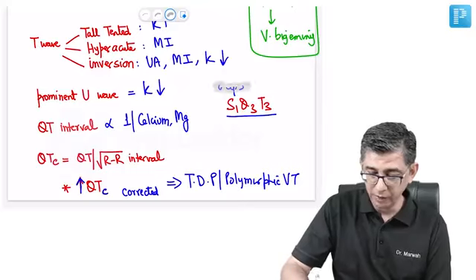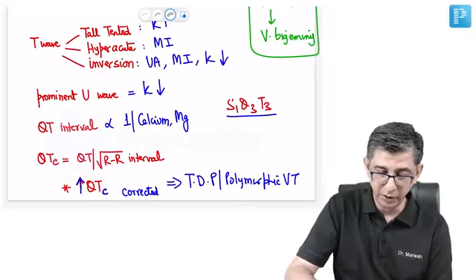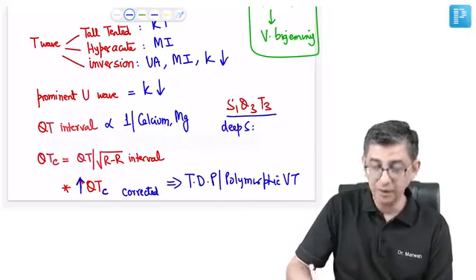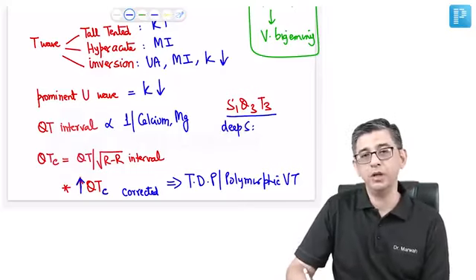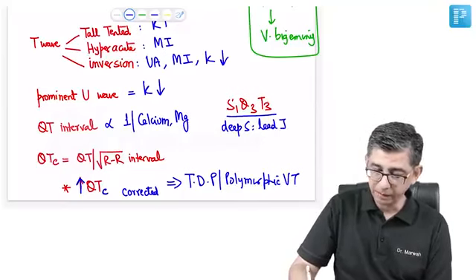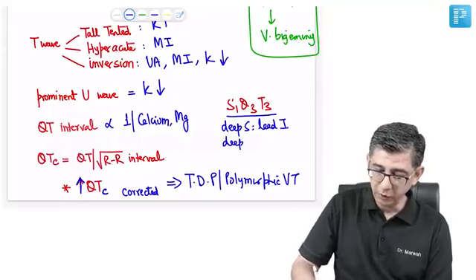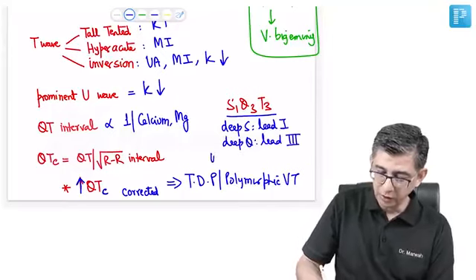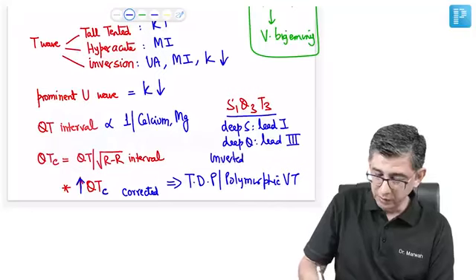In fact, I can say why the examiner can ask you this is because of the fact that the name is like that, S1, Q3, T3. So there would be deep S in lead 1. Then it would be deep Q waves in lead 3. And it would be inverted T waves with respect to lead number 3 again.